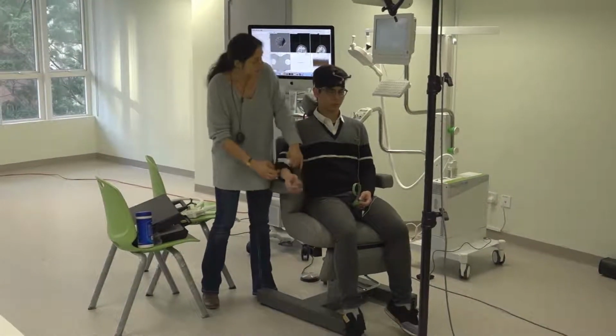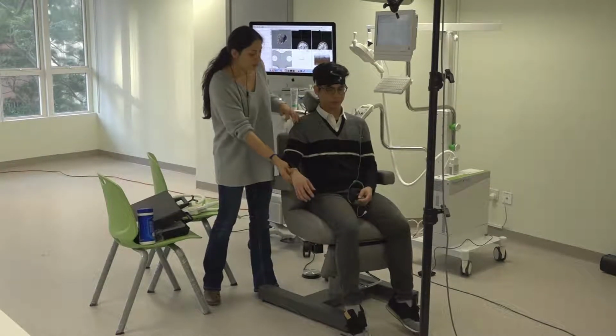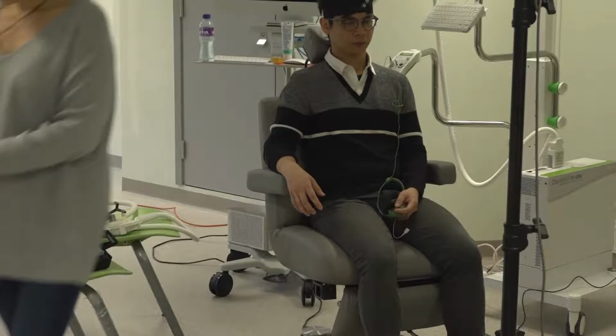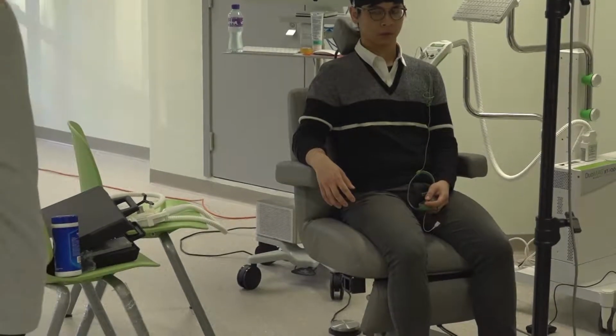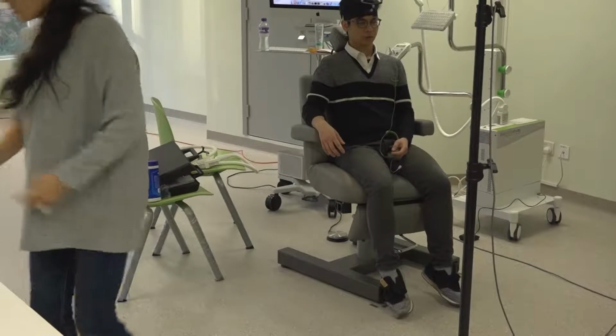And you have everything removed, right? You don't have any watch or necklace or earrings or everything. Everything should be removed. I'm gonna remove this just because it's comfortable. And definitely I'm gonna remove this because I should not use this. And doing TMS.